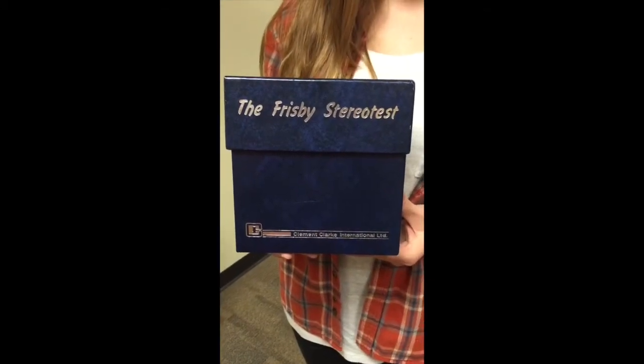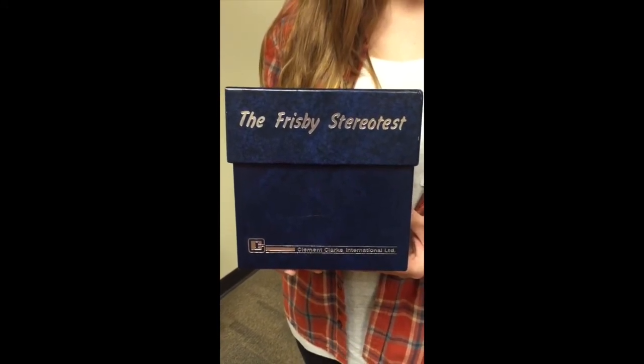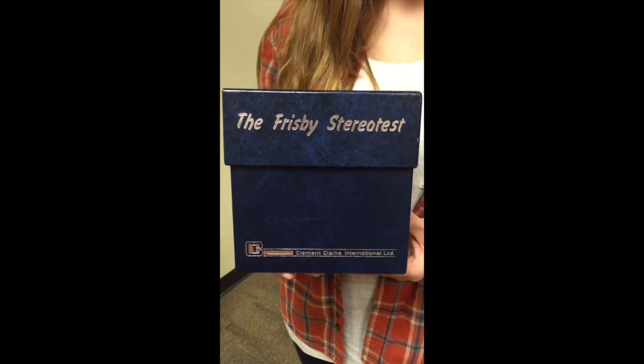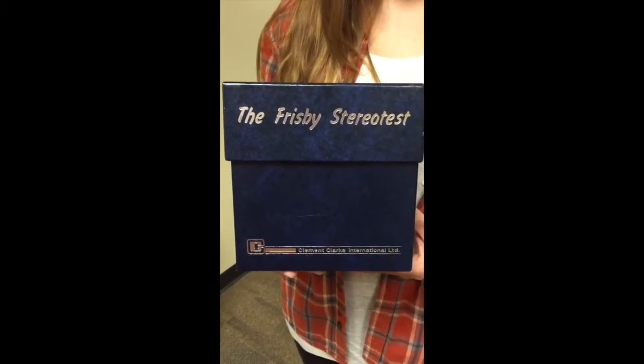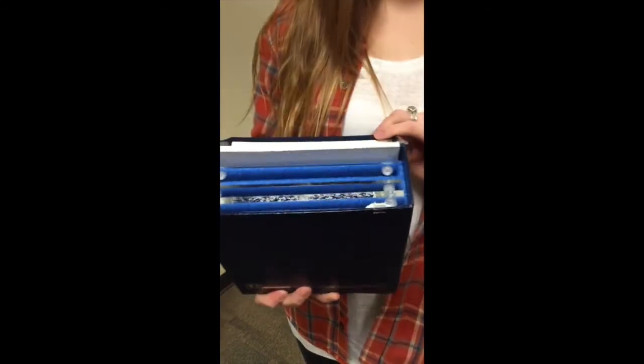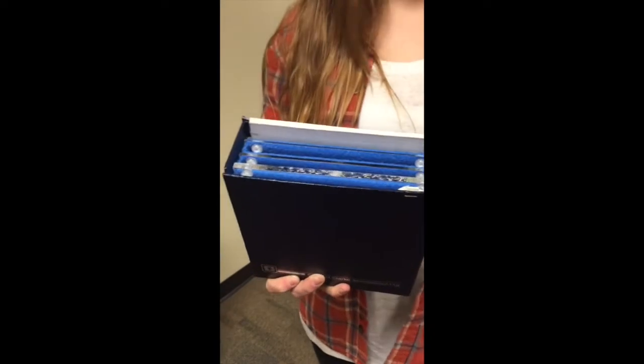Today we're going to learn how to do stereopsis using the Frisby Stereotest, and this test helps us to measure stereopsis without the need for special glasses. When we do this test in lab, we can use the 1.5 millimeter or the 3 millimeter test, but today we're going to use the 3 millimeter test for our purposes.